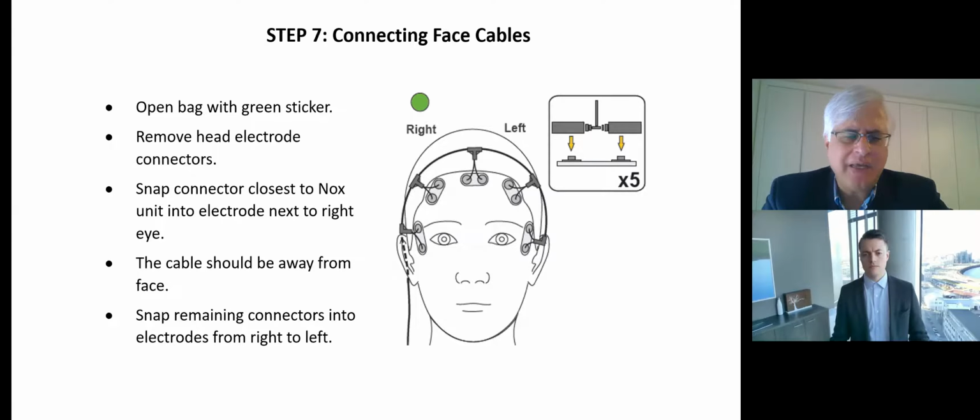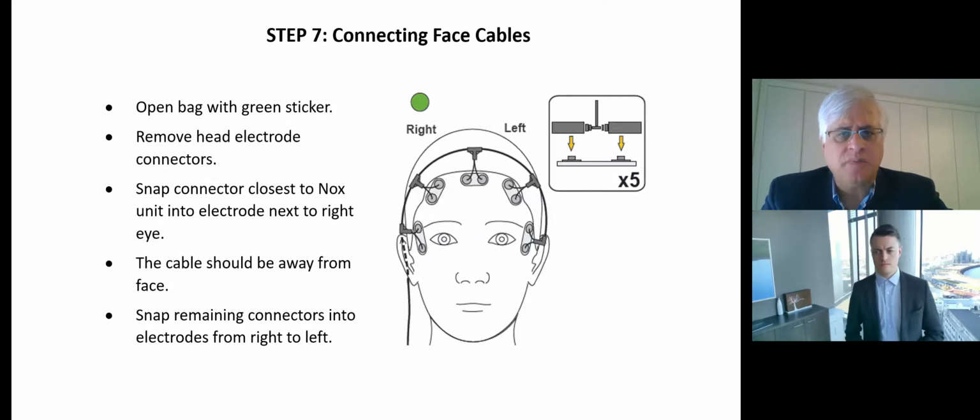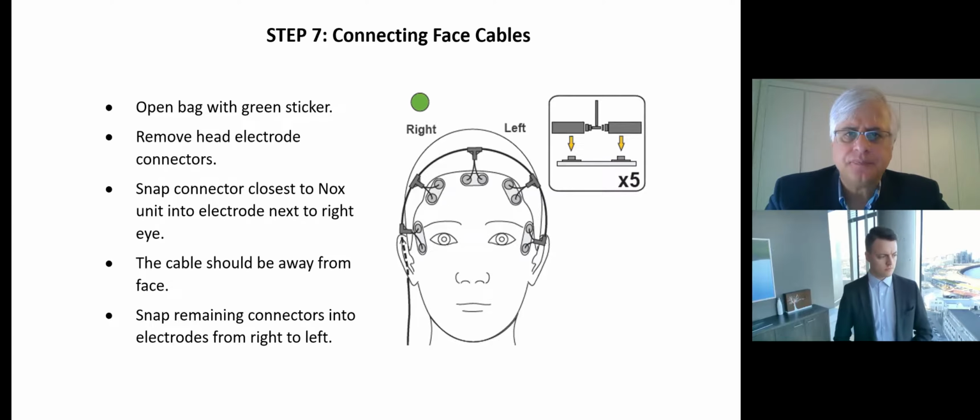And we really haven't had much signal loss or signal artifact with regards to the EEG. And I think most of you will be surprised that EEG is not one of our signals that is most problematic when you try to do home full montage polysomnography.